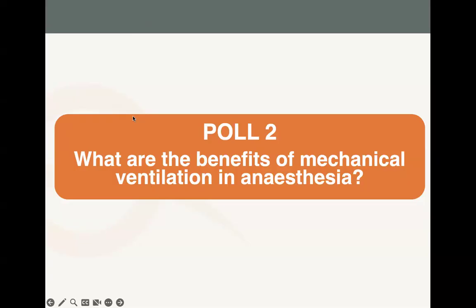Yeah, mechanical ventilation helps to protect the airway. The answer was to monitor ventilation and that for those patients who have a low Glasgow scale.